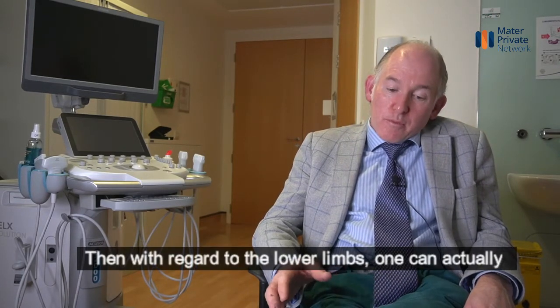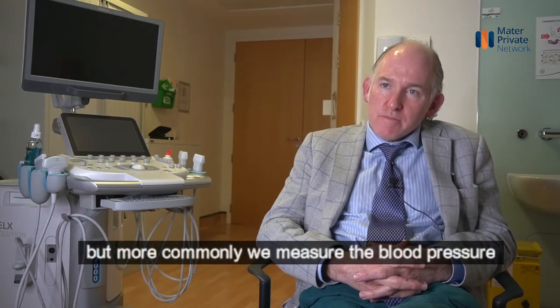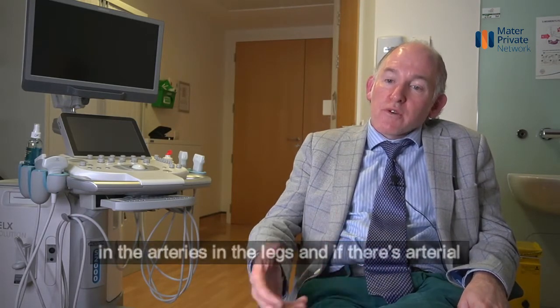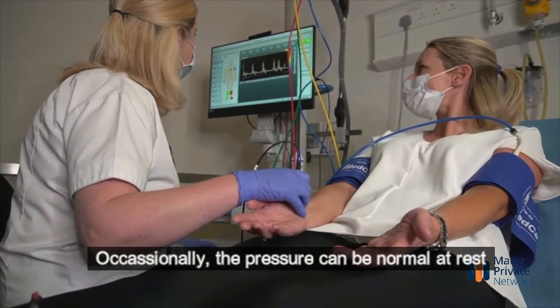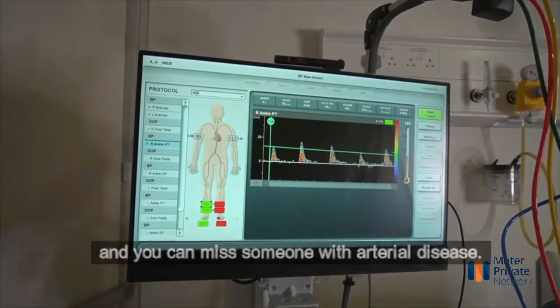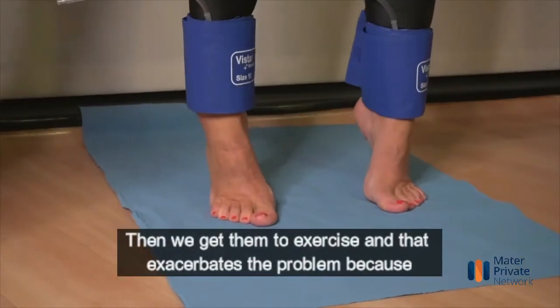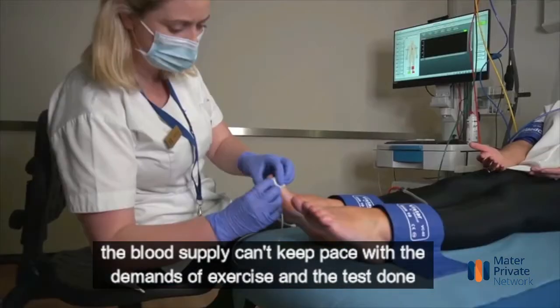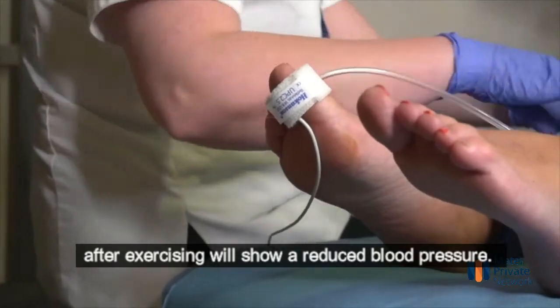Then with regard to the lower limbs, one can actually scan the arteries directly, which we do occasionally, but more commonly we measure the blood pressure in the arteries in the legs. And if there's arterial disease, the blood pressure will be reduced. Occasionally the pressure can be normal at rest, and you can miss someone with arterial disease. Then we get them to exercise, and that exacerbates the problem, because the blood supply can't keep pace with the demands of exercise, and the test done after exercising will show a reduced blood pressure.